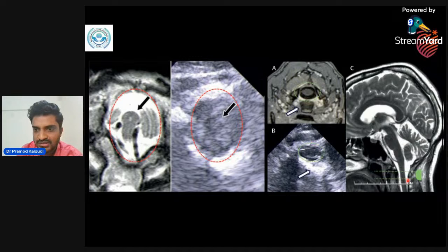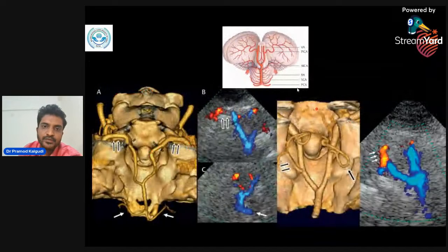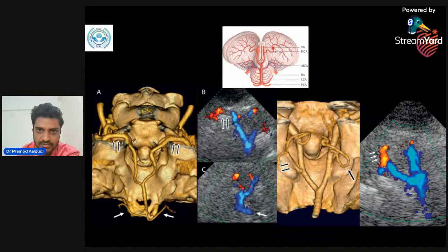So what happens? Your angulation might have gone horizontal. What you're seeing now is the spinal cord and the spinous processes and the spine here. This is not the foramen magnum. So you need to angulate it higher up, pointing towards the glabella of the patient. As you see here, the first two branches which we will be able to see from below upwards are your vertebrals ascending up, joining to become basilar, and basilar giving branches to PCA.